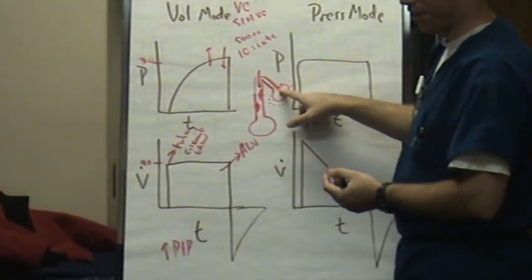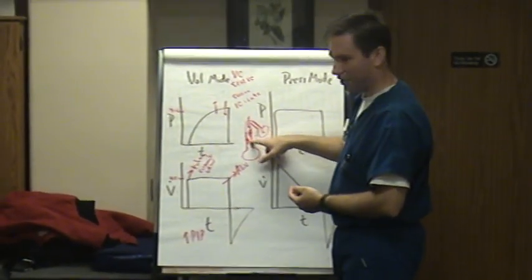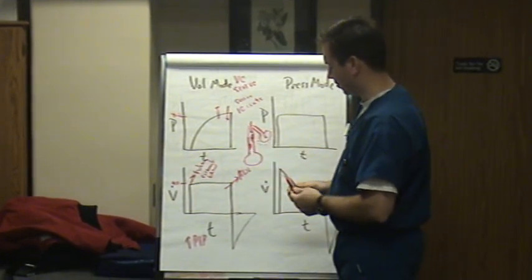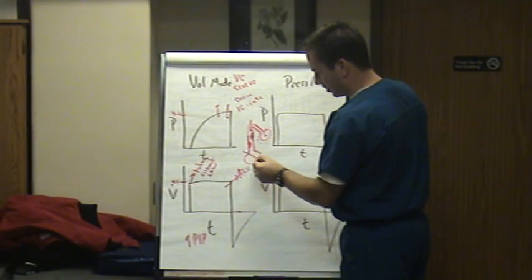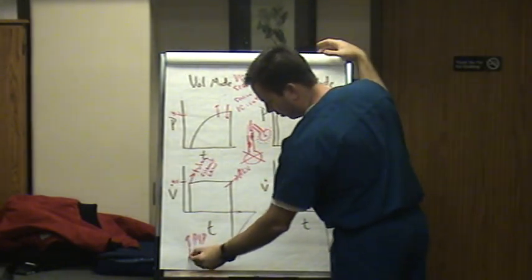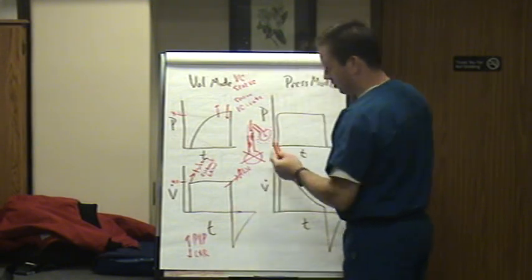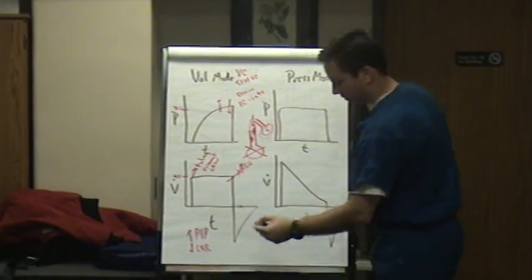And so it goes to healthy lung, and the lung that's salvageable, we cause an air leak on, and we never even pop that open because we have this flow that's down here subjecting that airway to a lot of trauma. So our peaks go up. So if this collapses, then you would assume that our x-ray is going to go south on us, isn't it? And then obviously we lose diffusion, so what's our pulse ox usually doing at this point? It's going to hit the floor too.